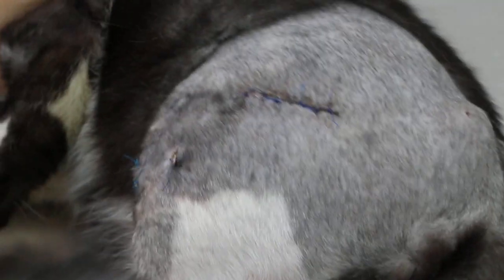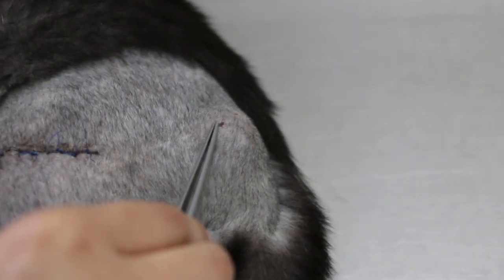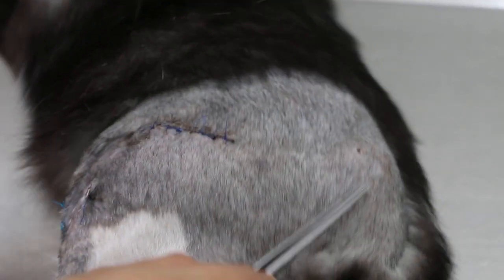Now you will see the surgery site again. You can see the stitches — any infection? No infection. The stitches are on the skin. And here, this part is where the pin is, and this is where the pin will be removed later.